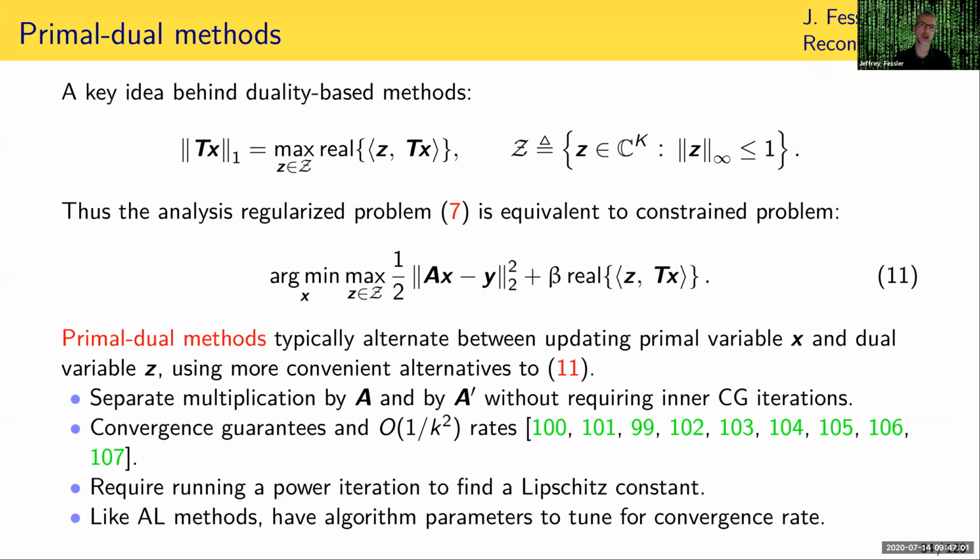Now, once you've reconstructed the images, for display to a doctor, you typically just take the magnitude, and a whole lot of image processing is typically just done on the magnitude of the reconstructed images. So those are then real images. But the reconstruction problem is done with complex images. So I hope that answers that question.